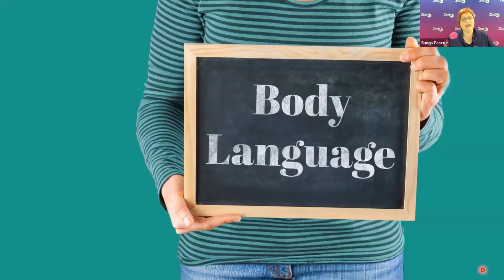And so it's important that our body language communicates as much as anything that maybe it's not good. So you can use your body language, but also just be aware that your body language will communicate. So if you get on and you're scanning and your face falls and you're not quite ready, the questions are going to come from your patient really quickly. So just be mindful, your body language will tell a story as you're conducting these scans.